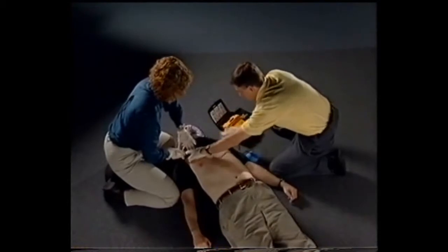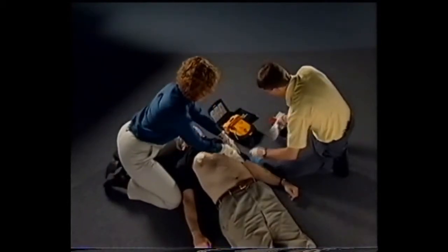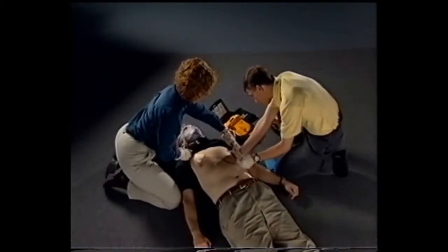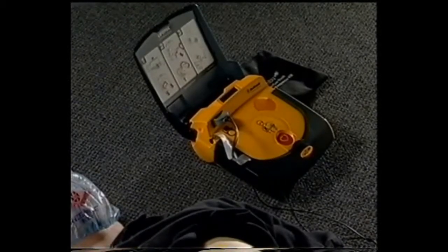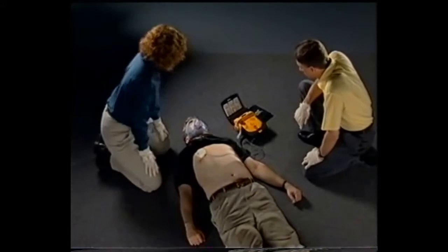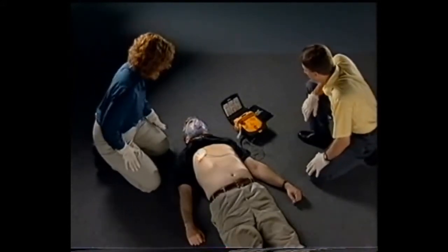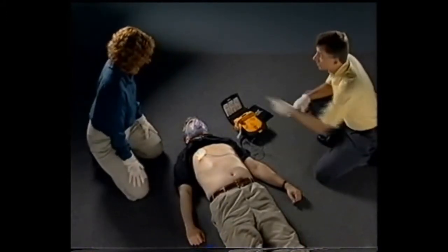Disposable electrodes or pads are placed on the chest and relay the heart's activity to the defibrillator. When the pads are applied, the defibrillator evaluates the heart's rhythm. Do not touch patient. Evaluating heart rhythm. If ventricular fibrillation is detected, the defibrillator prepares to deliver a shock. Stand by. Preparing to shock. The defibrillator instructs you to deliver a shock to the heart. Everyone clear. Press flashing button.